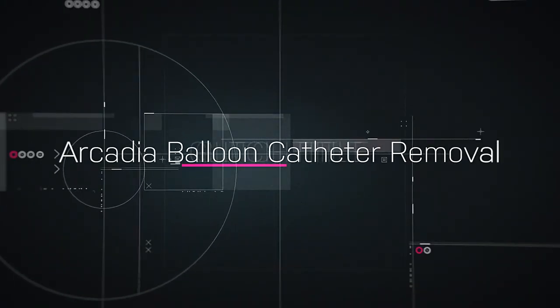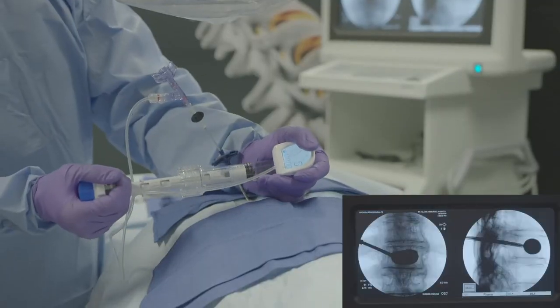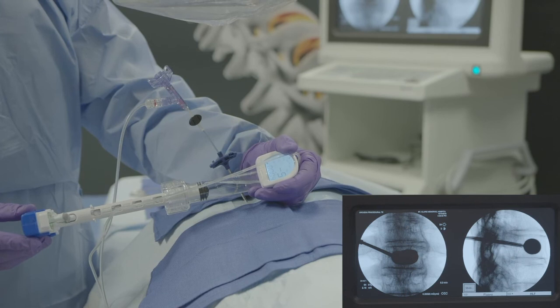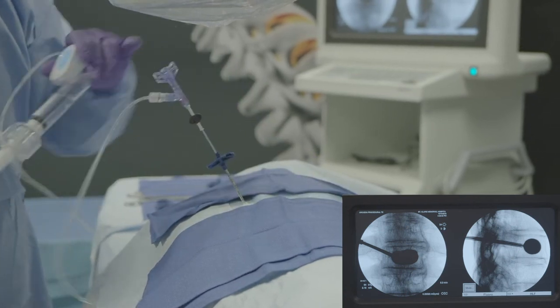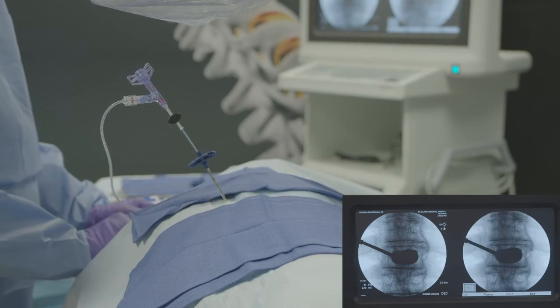Arcadia Balloon Catheter Removal. Deflate the balloon before removal by pulling the inflation device plunger all the way back and removing all contrast medium from the balloon. Return the steering mechanism to the starting position by turning the steering handle counterclockwise before removal until the hard stop is detected.